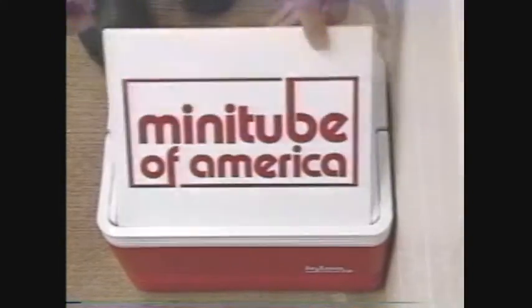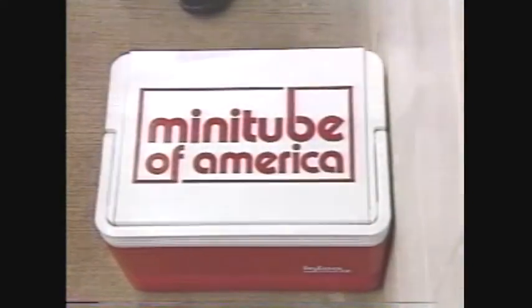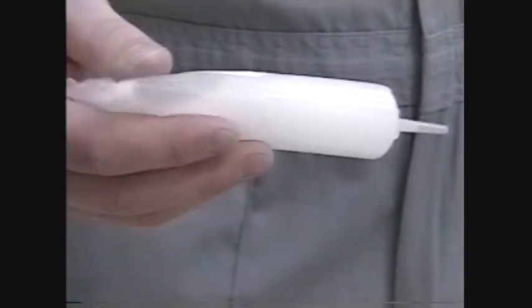Gently pull back on the catheter until it is possible to feel resistance, ensuring that the lock is good. Note, if a lock is not achieved, it may be necessary to remove the catheter and start again. Take the semen dose from the storage container and check that the semen is from the correct boar. Resuspend the dose of semen gently. Cut the tip off the tube or bottle and attach it to the stem of the catheter. Rotate the catheter a quarter turn counterclockwise to reinforce the lock. Lift the end of the catheter and allow the semen to flow through the catheter into the cervix.